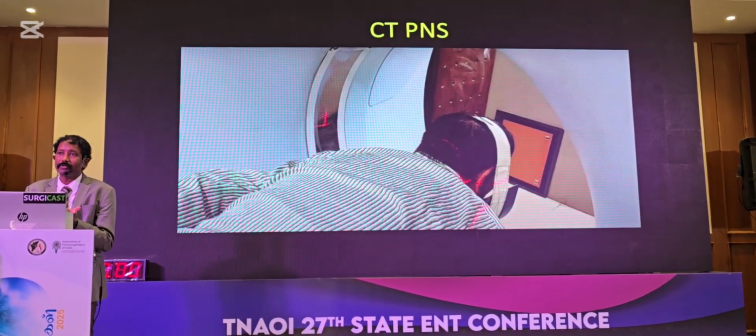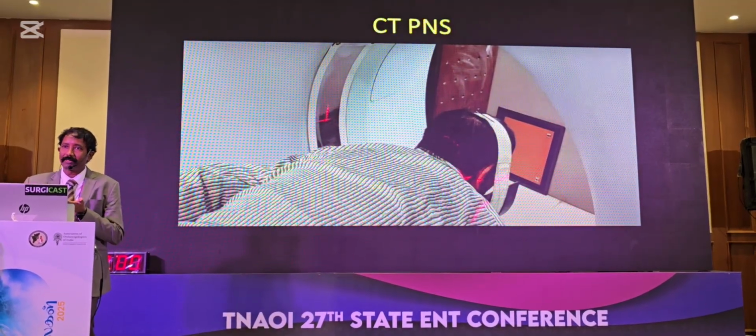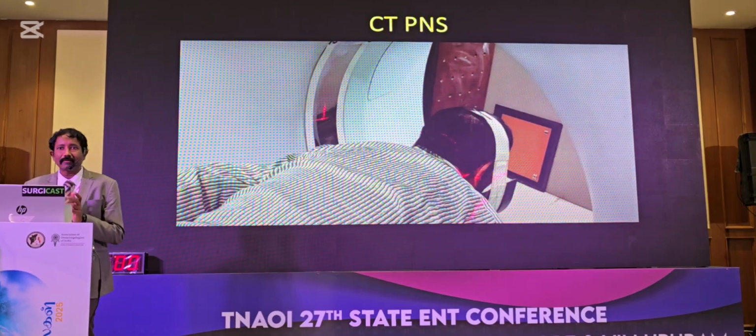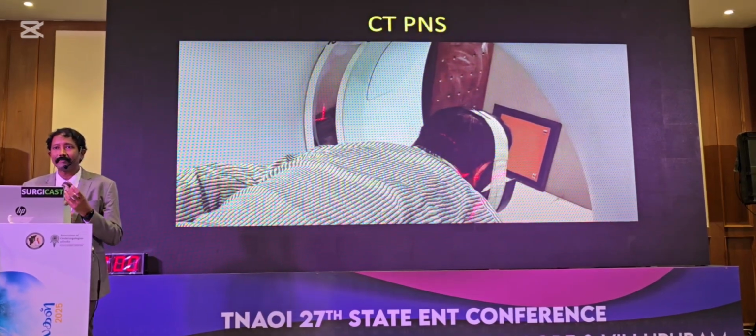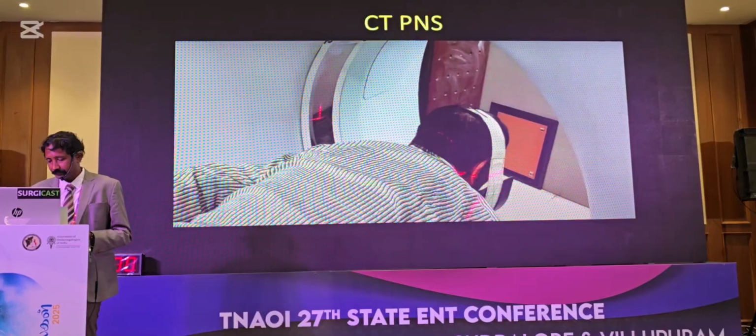If the patient is going to be in supine position and if you are going to take axial views and if you reconstruct it to the coronal view, then the soft tissue inside the sinuses remain in doubt whether it is soft tissue or is it fluid, etc. Right.